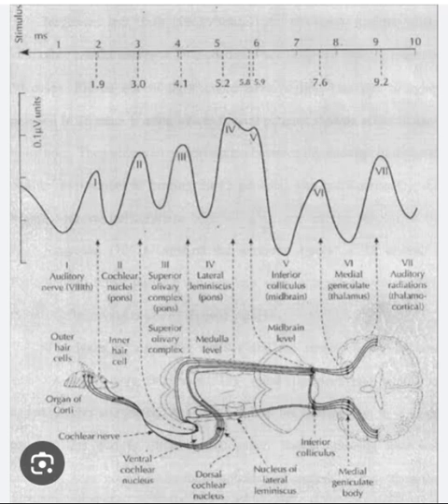Subject variability. Individual factors can influence BERA recordings. Age, attention, arousal, and state of consciousness can impact the waveform characteristics. Additionally, pre-existing conditions such as hearing loss, neurological disorders, or medications can alter BERA responses, making interpretation more challenging.